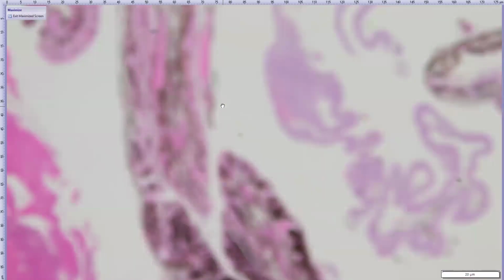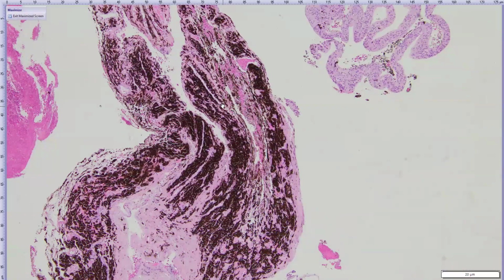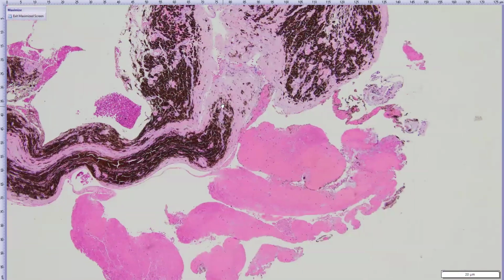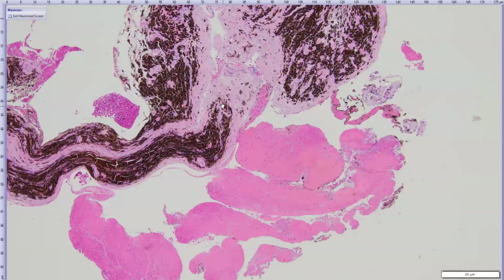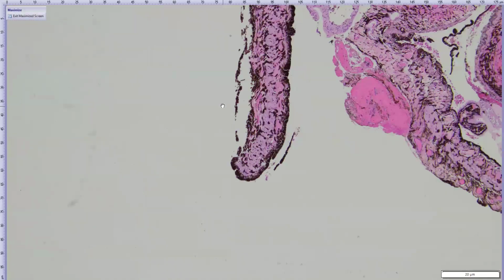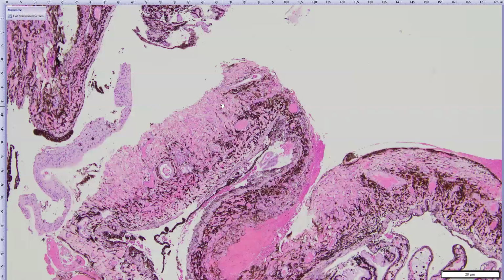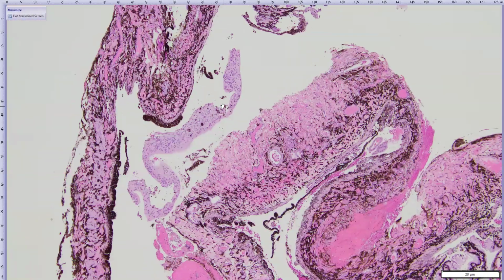And then, like I said, our uveal tract is here. There was not any evidence of inflammation or membrane formation to account for the glaucoma that they did report clinically. They said the IOP ranged from 51 to 90, possibly due to the anterior lens luxation that they reported clinically, getting maybe a little bit of a reading from the lens rather than the globe.